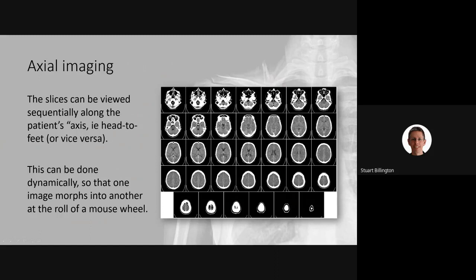And then what we do is the bed arrangement that the patient is lying on, we then move that bed through the scanner. So as the patient moves through the scanner, in one rotation of that very fast moving gantry that you just saw, the patient might nudge forward 1 millimeter. And so by the time 360 degrees has taken place and it starts the second rotation, there's a different millimeter of patient axially from head to toe underneath the beam of the X-rays.